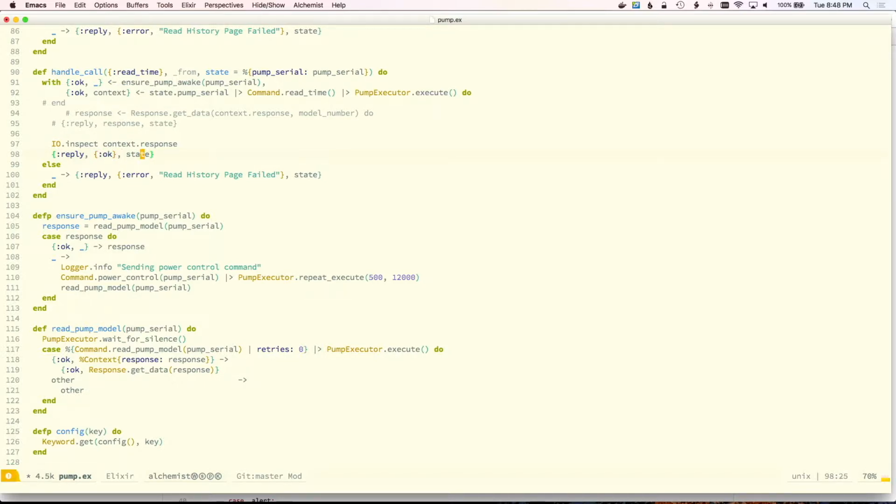And really the only state in here is the pump model number. That's important, but if I let this pump GenServer crash, then all I really need to start it back up is the pump serial number. It can turn right back around and say, hey, if I don't have enough information to know what model you are, and the model number is important for decoding certain parts of history, like the newer pumps have longer bytes in some of the command responses, and they have a little bit more precision in some of the answers that they give. So you have to know what pump model you're working with in order to decode the information correctly. But if I lose that data, I can always get it back just from the serial, and then I can wake the pump up and ask it what model number it is.